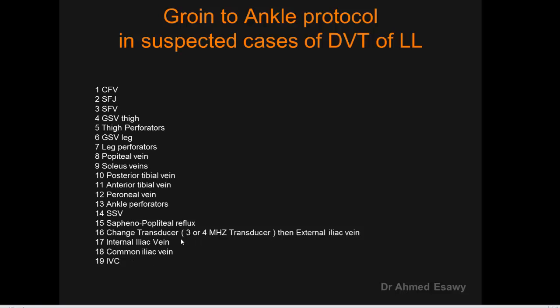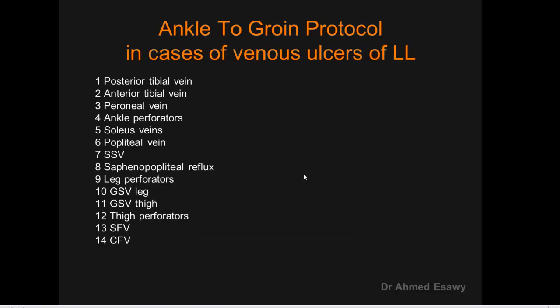After changing the transducer, we then examine the external iliac vein above, internal iliac vein, common iliac vein, and IVC.